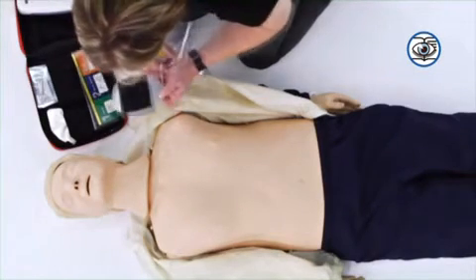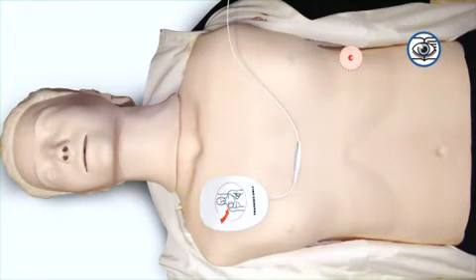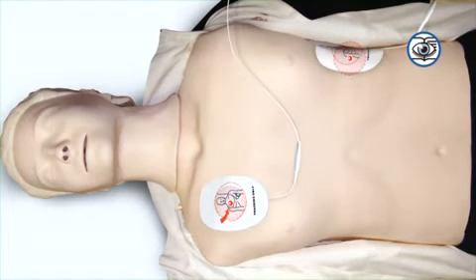Place one pad on the right, just under the collarbone and above the right nipple. Place the second pad under the left nipple and in line with the center of the armpit. Correct positioning of the defibrillation pads is one of the most important steps of AED use. Correct placement ensures that the controlled electrical shock will pass through enough heart muscle and stop ventricular fibrillation. The patient must be unresponsive and not breathing prior to applying the AED pads.